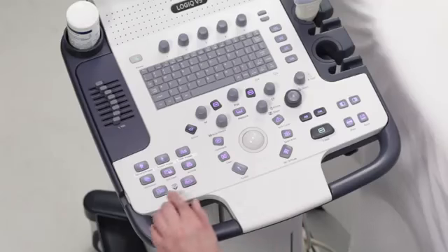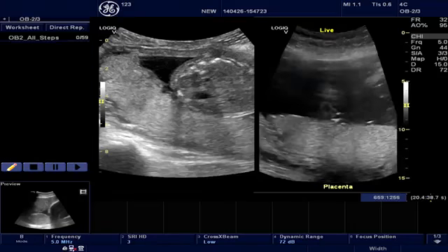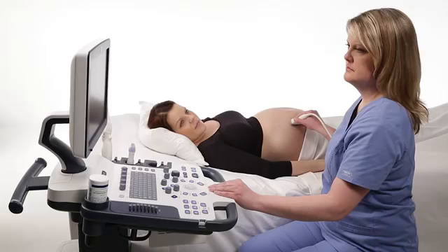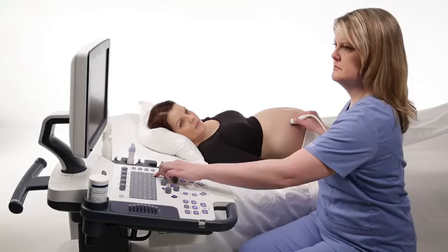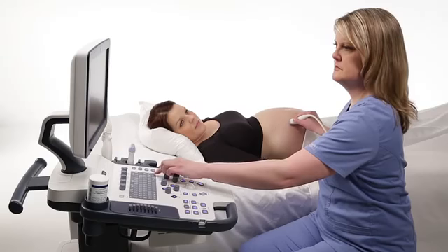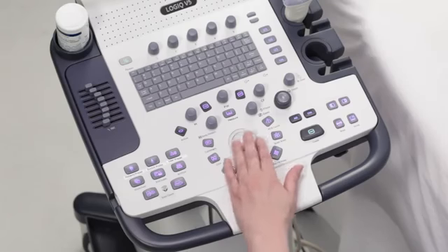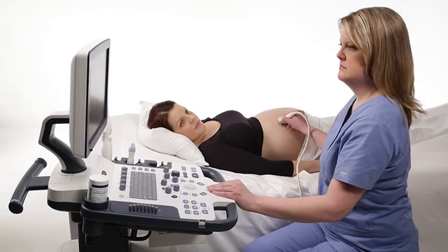The user can hide the reference image and/or the animations when these are not needed. The user can navigate between steps of the protocol using the up and down arrow keys on the keyboard. An alternate method to activate or hide the reference image is to click on the highlighted question mark icon seen along with the scan plane view.